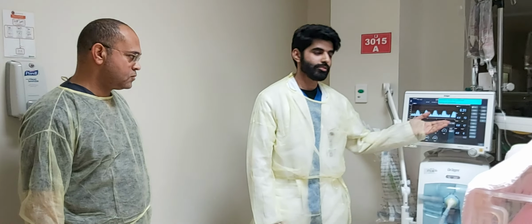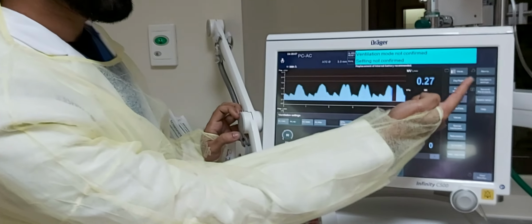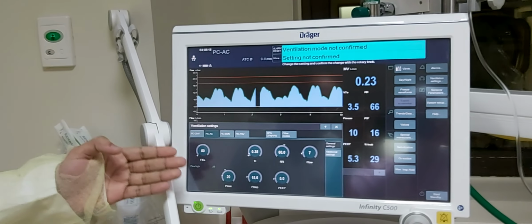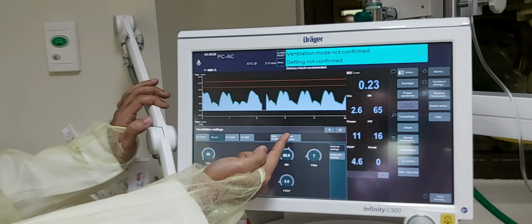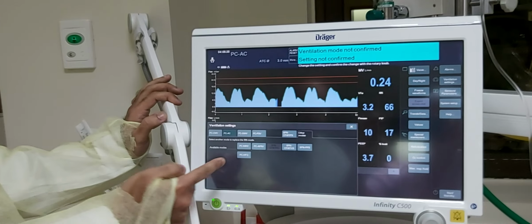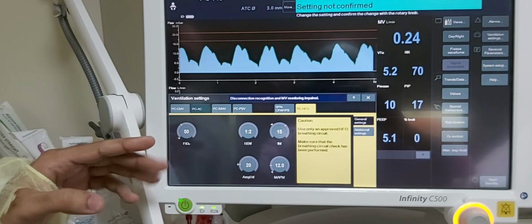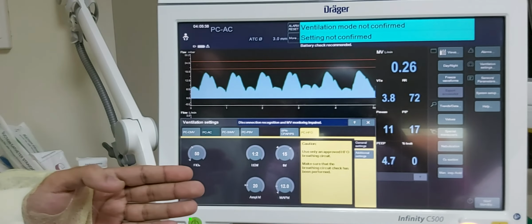You can go to the screen. Then to the right corner, it shows the ventilator settings. You press the ventilator settings, and it will show the ventilator modes, the conventional modes, which we won't be discussing. We will discuss the other modes: you can go here, then put the high frequency ventilation in the second row. After that, it will show 5 parameters. One is fixed, which is the I:E ratio, 1 to 2 for all patients.